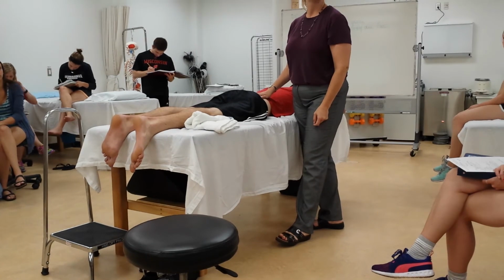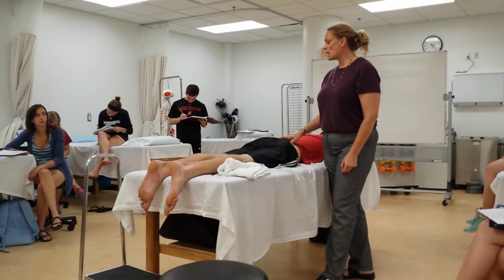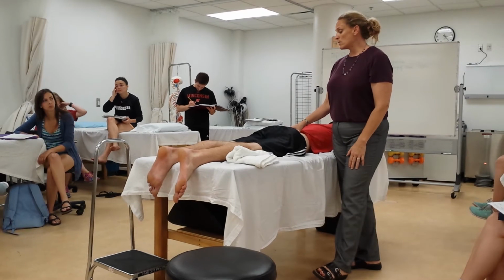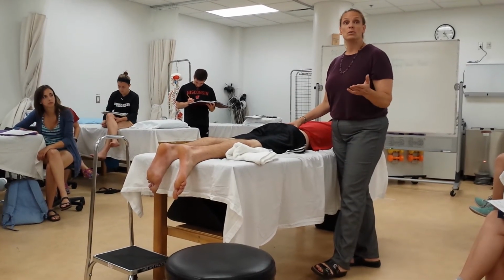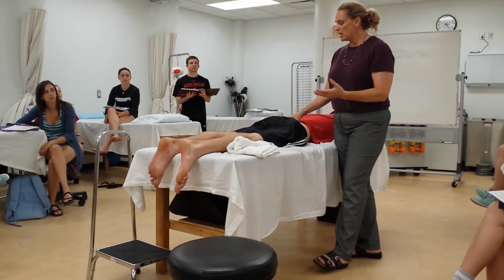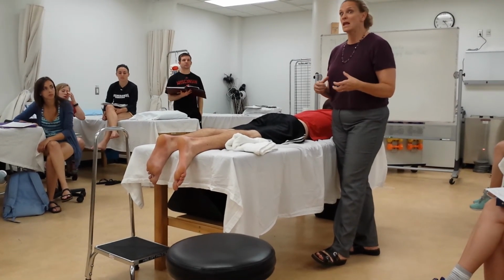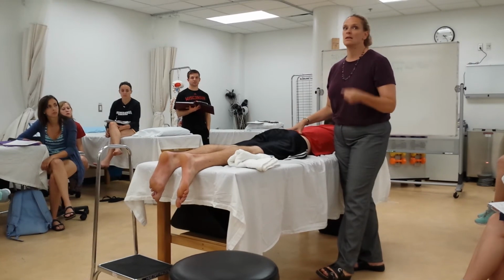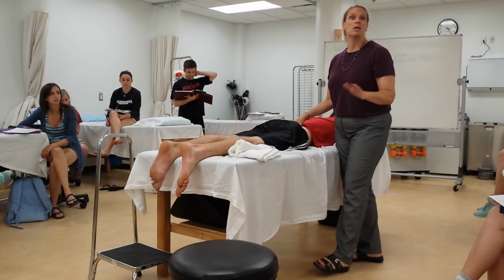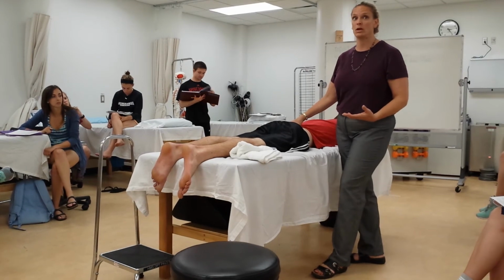So should you cue him to tighten up his core to try to keep that pelvis from falling too anteriorly, or just let him do whatever? Yeah, so you certainly could do that. It depends if you're doing passive or active. If you're doing passive, I would not do that. If you're doing active, like I've been demonstrating, the only concern I would have is that people will tend to contract both anterior and posterior muscles, and then you might get co-contraction of the hams and quads, and then you're in trouble. Okay? So you can try that with someone, and it might work really well. Other people, it may not work so well.